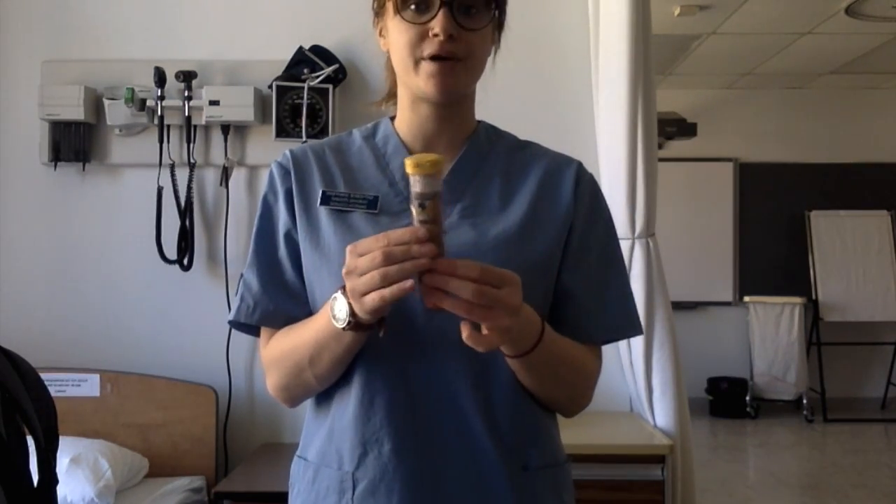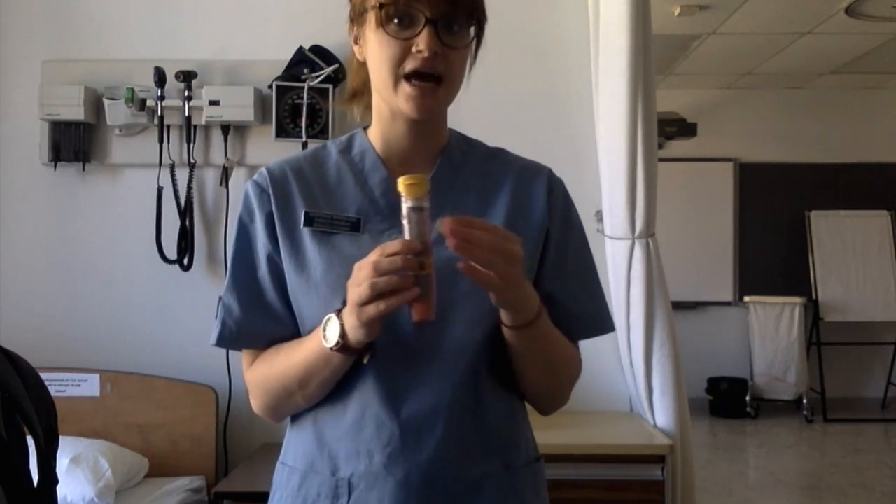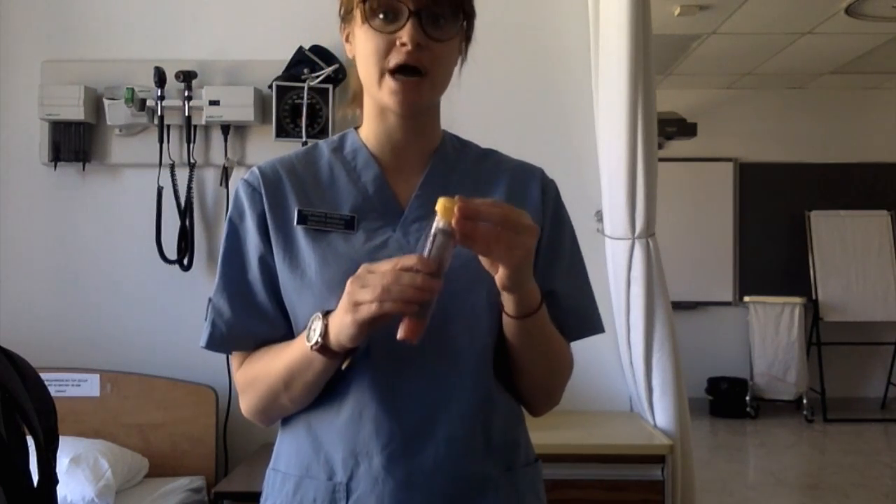The first thing you should remember is that the EpiPen comes in a yellow container. This yellow container means it's an adult dose. If it were in a green container, it would mean it's a child dose.